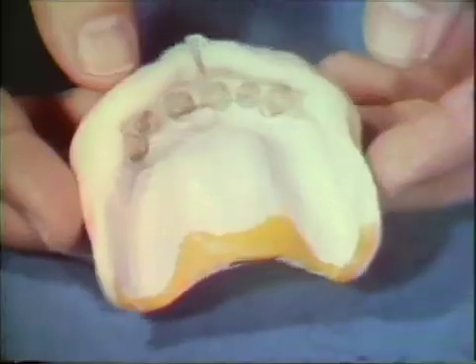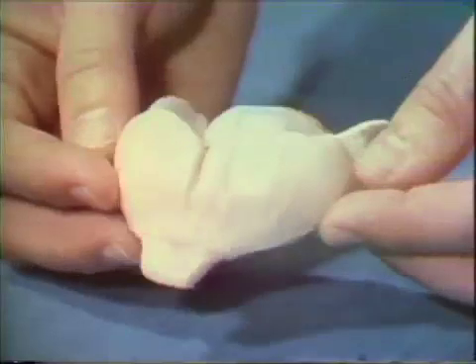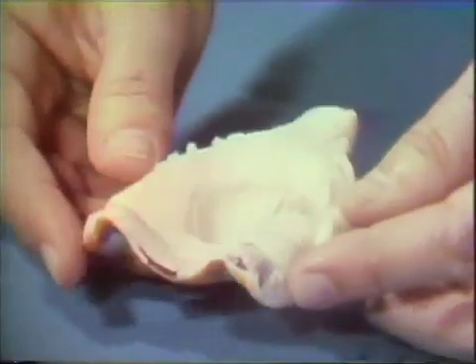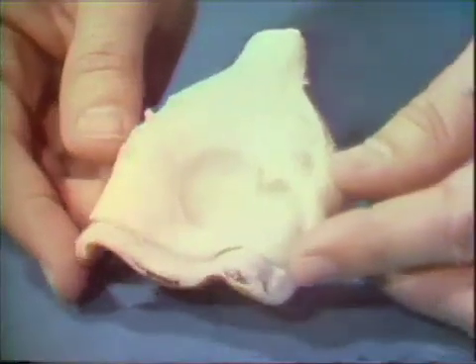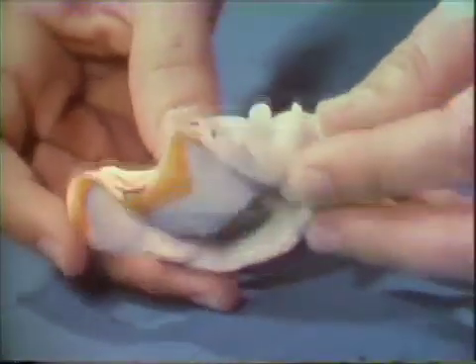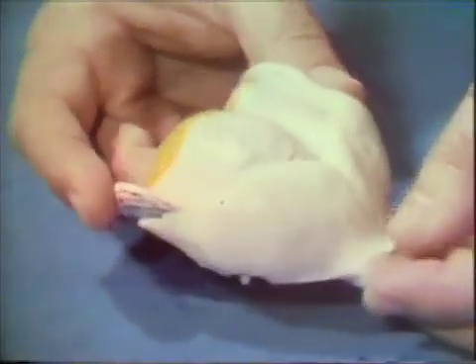Although the construction of custom trays requires slightly more laboratory time, the following advantages are enjoyed: one, control of the border extensions; two, permits the use of a functional type of post-palatal seal; and three, the edentulous portion of the final impression may be used as a stable record base.